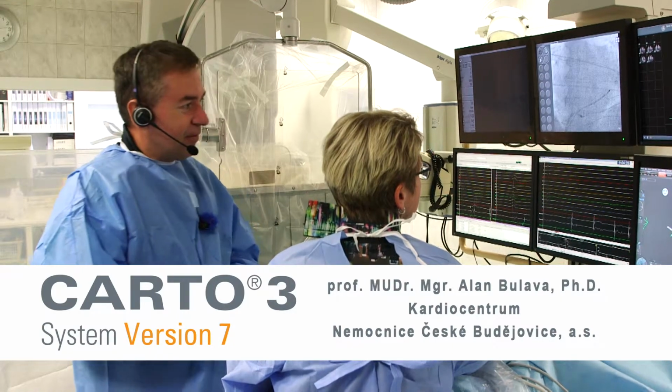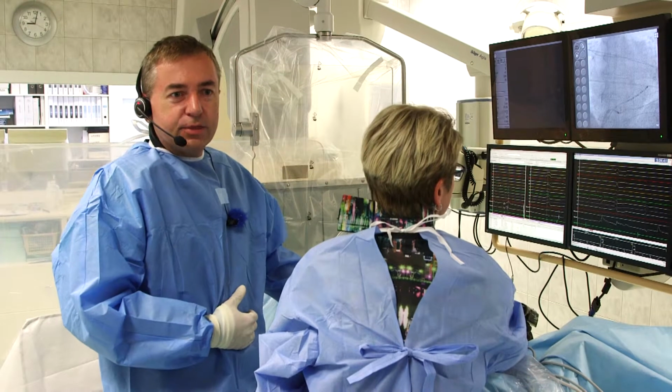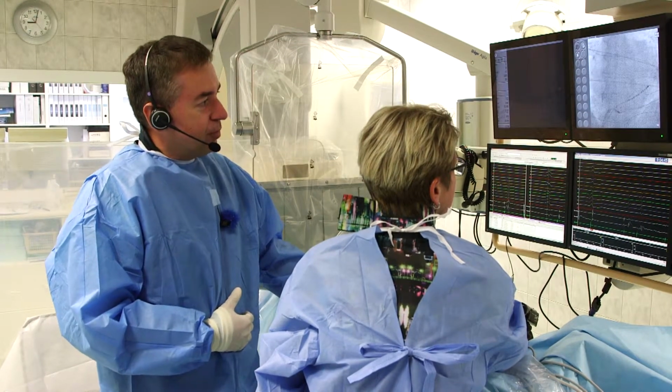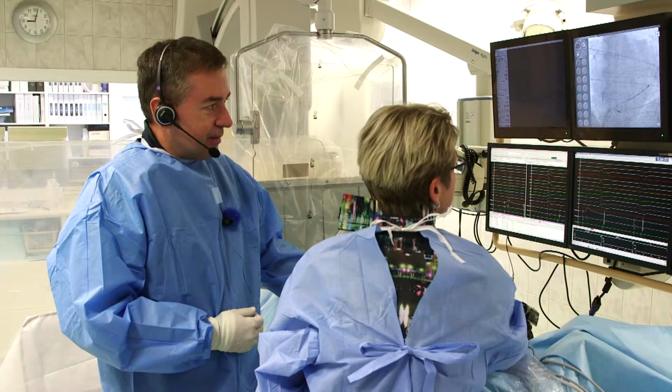I'd like to sincerely welcome you in the EP lab of the Cardiac Center in České Budějovice, Czech Republic. Today we will focus on the new software version of the Carto 3D mapping system, version 7. The Carto 3 version 7 Carto Prime brings many innovative changes.